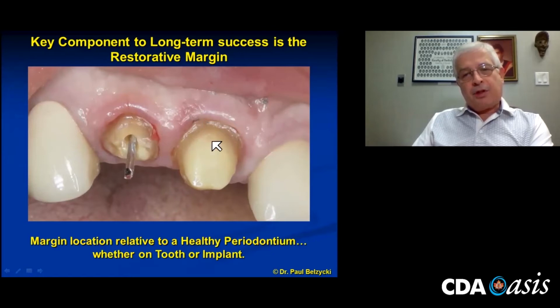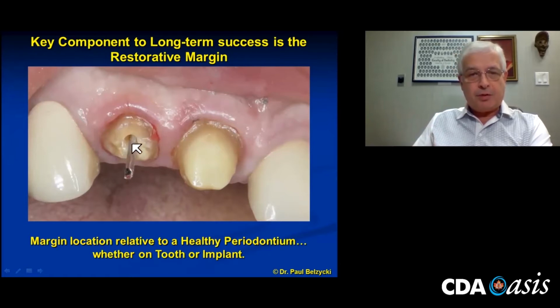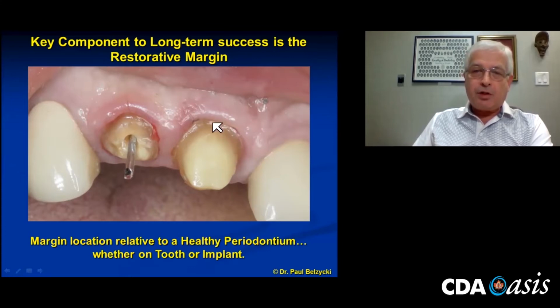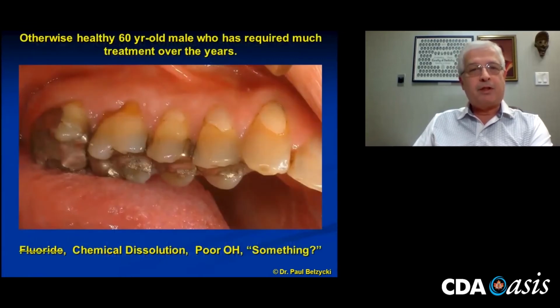This is the tooth. I have not touched this tooth since I cut the crown off. I've been working on this tooth, doing the endo and getting it ready for a cast post core. So this tooth, it looks like the day I cemented it in. And the cement looks like the day I cemented it in. And that's just no brilliance, just dedication to detail, making sure that my margins are just tucked underneath the skin and having a good lab that can make something worth putting into somebody's mouth.